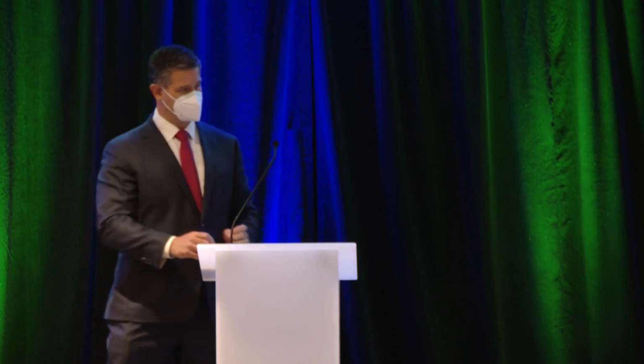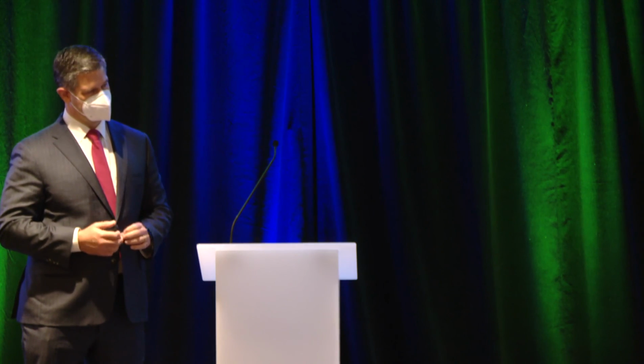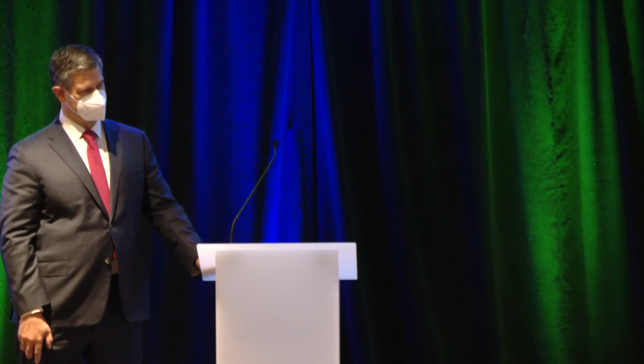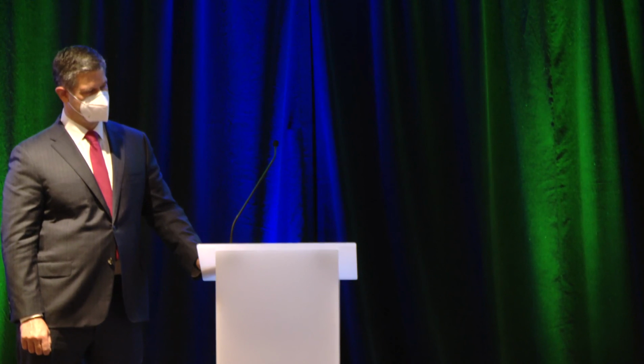I think the key is to send your personnel who do procedures to courses like this, because each of those elements in the Chicago 4 helps you not do the wrong thing in a patient. So if you're diagnosing EGJ outflow obstruction from 10 swallows, that may not be real. It may just be related to catheter position. If that's the case, you sit the patient up, that abnormality goes away. You do a rapid drink challenge, that abnormality goes away. So it is important so that you don't do the wrong thing in the patient. You can't be treating somebody with an elevated IRP just in the supine position if esophageal body contractility is normal. It's meant for those fringes of abnormalities.